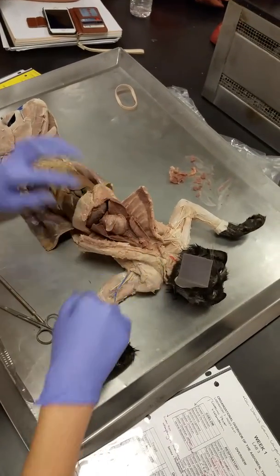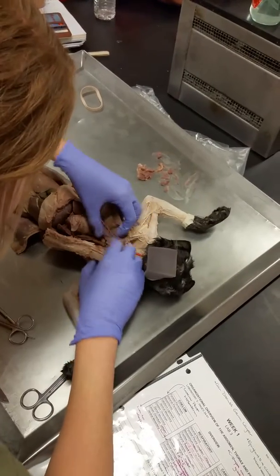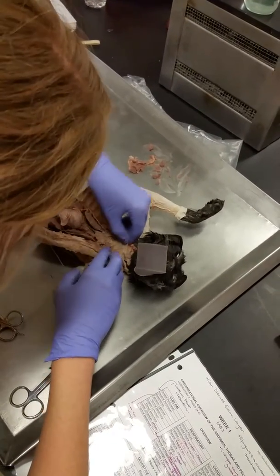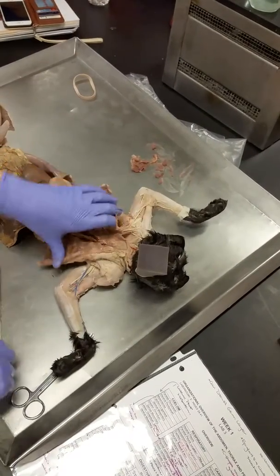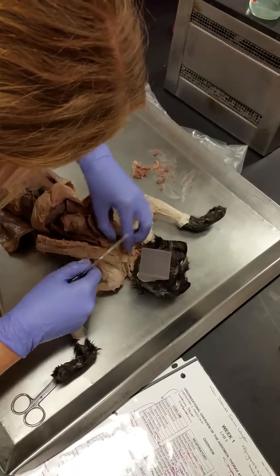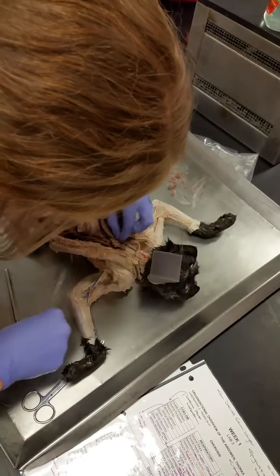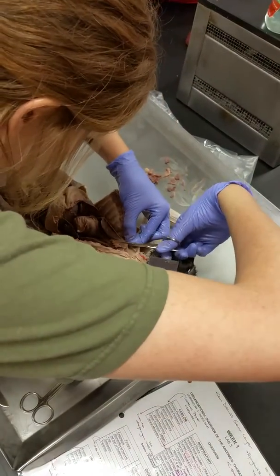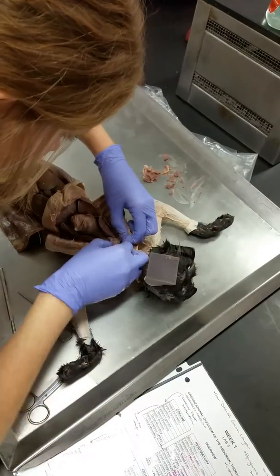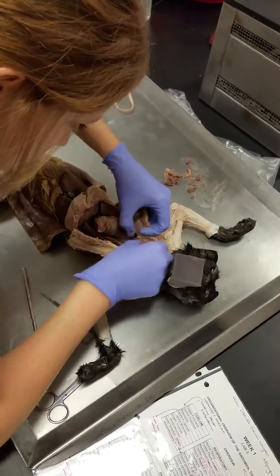All right. Let's see then. I don't usually do this. Let's do it. Okay, so we need to go a little bit deeper up in the throat here. There we go.